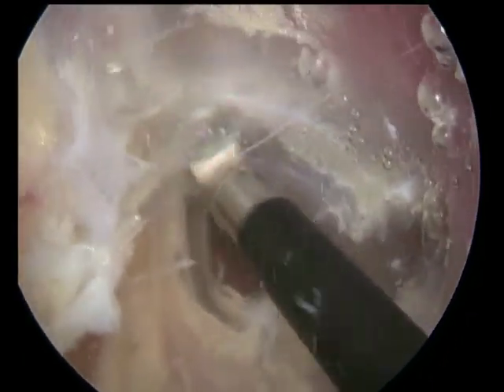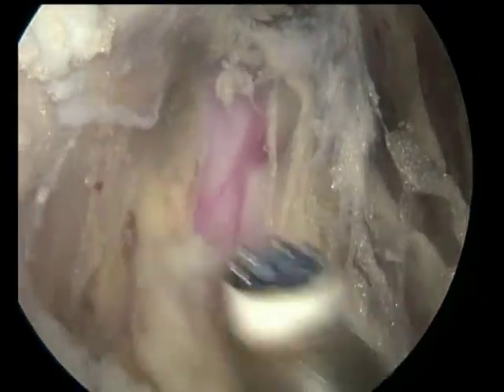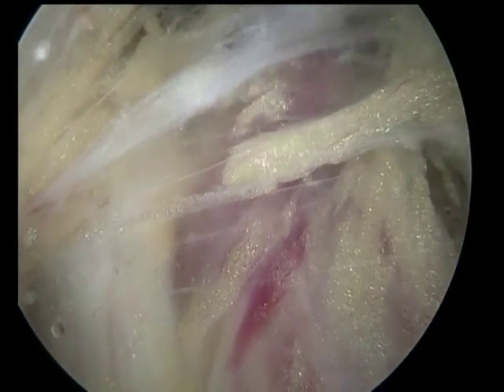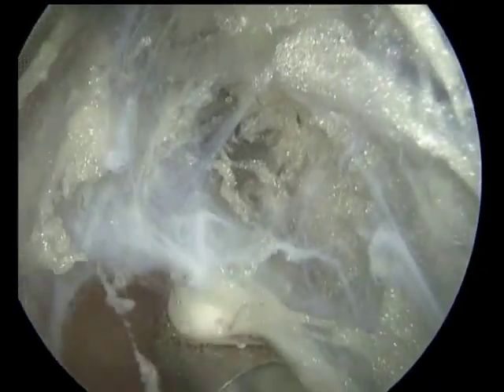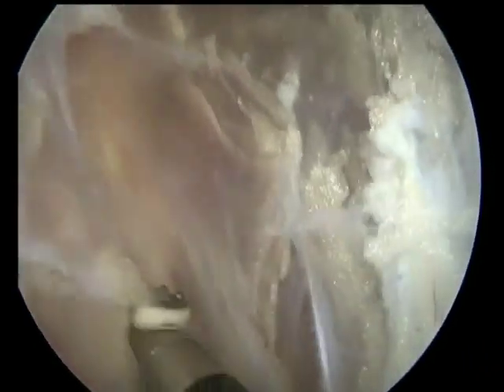And after visualization of ischial tuberosity, we start to prolong our release to the lateral direction. Sometimes we can meet an inferior gluteal artery in this area, which is located medially from the sciatic nerve. Then we continue our release in the lateral direction. We cut all adhesions and scars at this area and approach to the sciatic nerve and to the femoral bone. Sciatic nerve is located in between femoral bone and ischial tuberosity.